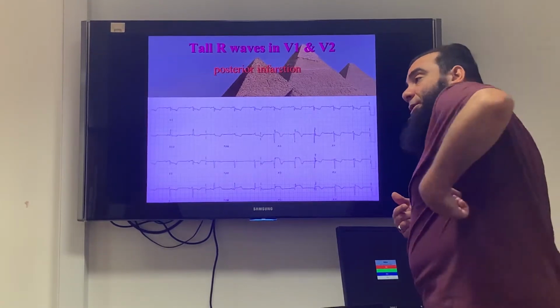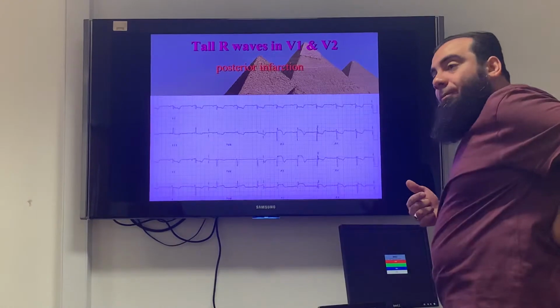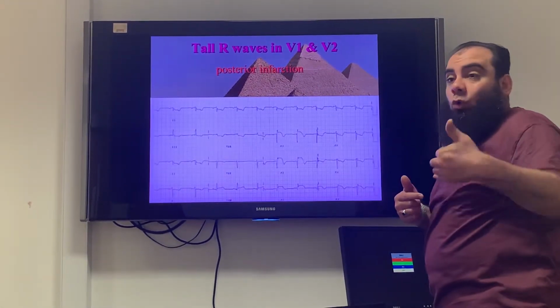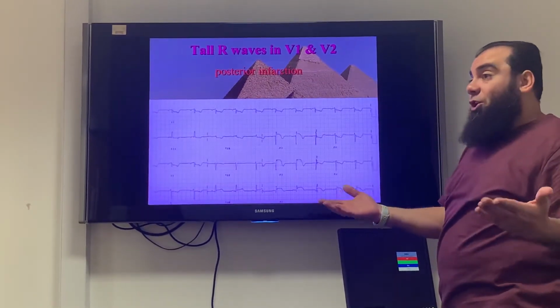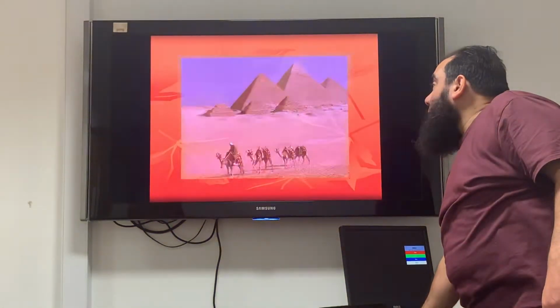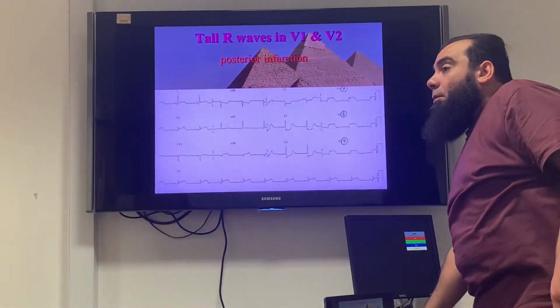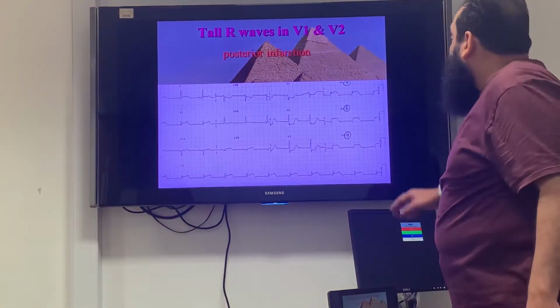So from that place to our mid spine, we can place 3 leads, 7, 8, and 9, and it's supposed to show the posterior wall. Then we can see the elevation, which we call posterior leads. So you just move your last 3 ECG electrodes to the back. You can do so, yeah. Just move them as we did here.